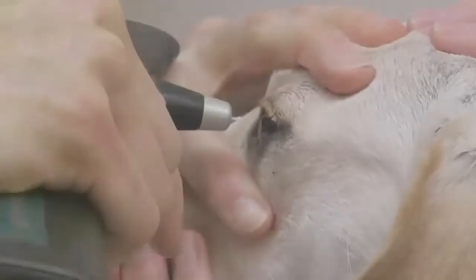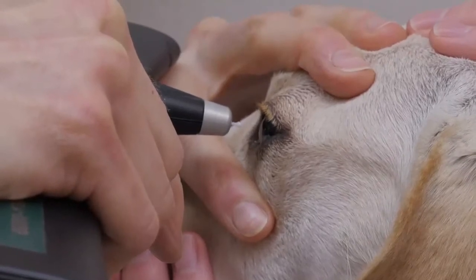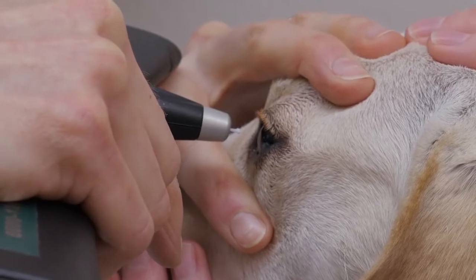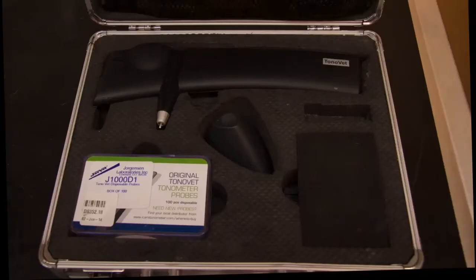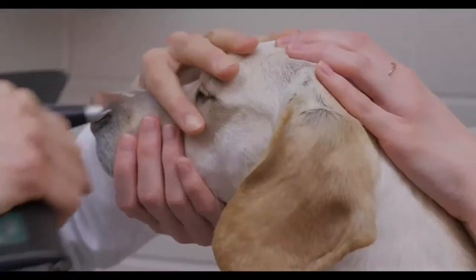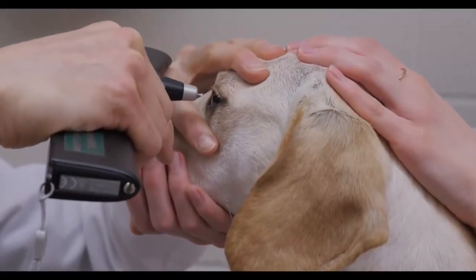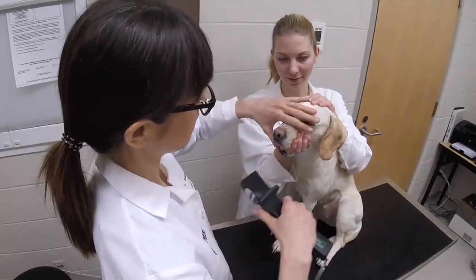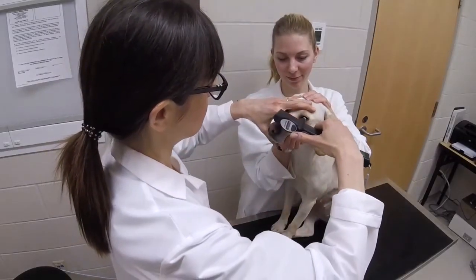Rebound tonometry. Rebound tonometers assess the interaction of a small metal probe as it strikes the cornea and rebounds back to the instrument. This is also a very accurate method of estimating intraocular pressure, and it has the advantage over indentation and applanation tonometry of not requiring the use of topical anesthesia prior to using the instrument.